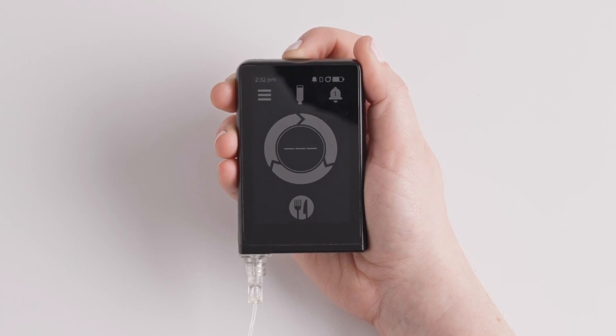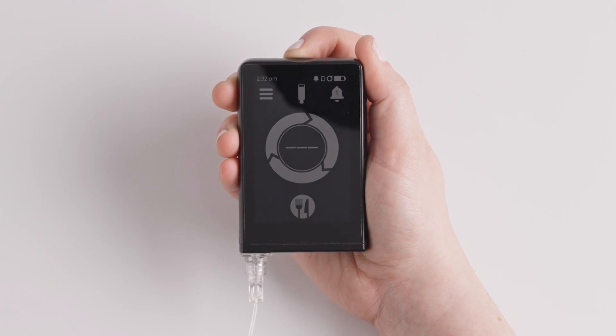Before you begin, make sure you have the supplies you will need. You need a new CGM sensor and an alcohol wipe.